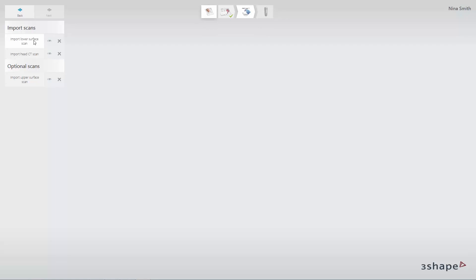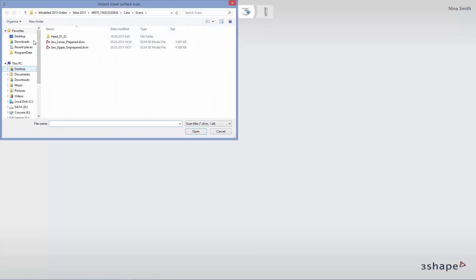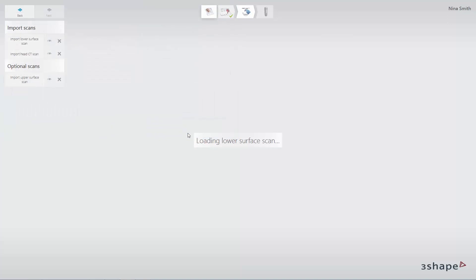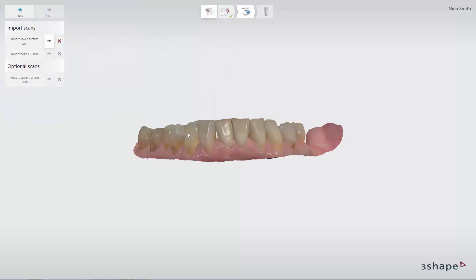To import a surface scan, click the Import button and find the correct STL or 3Shape .dcm file. Click Open and the scan will load. When it is done loading, it will appear in the preview in the center of the screen.